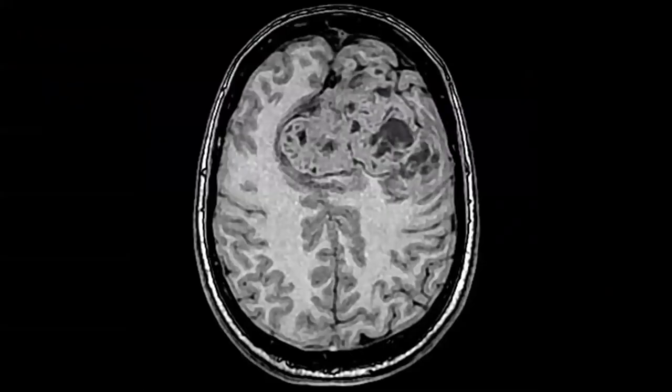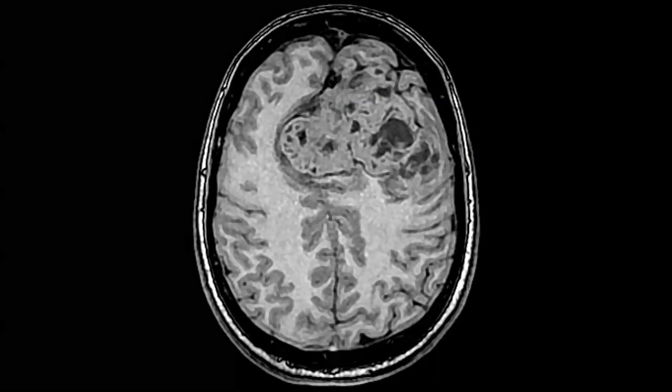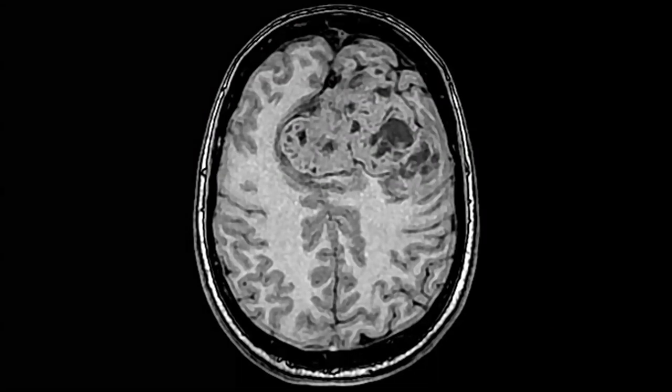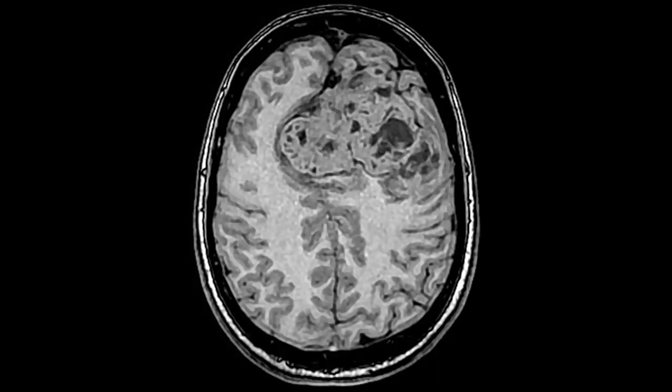MR image of the week. This is what I chose as the MR image. You'll have to admit, this is pretty striking. No? Anyone want to hazard a guess what it is? I think it's not really quite fair, but how about, not guess what it is, can anyone create a differential diagnosis? Just a differential.